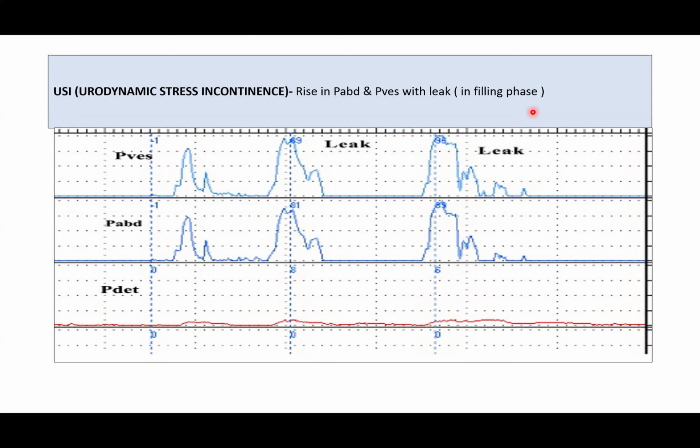There was a structured discussion task on sensory urgency as well. Doctor, is it only urodynamics? The bladder capacity will be reduced and there is no increase in the detrusor pressure. This is how it is differentiated by urodynamics.